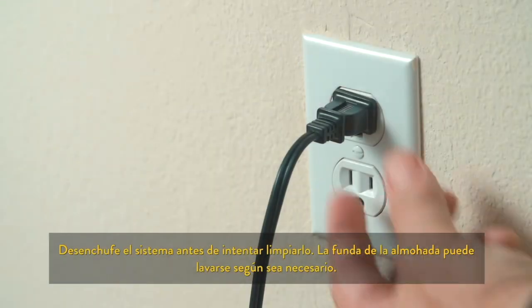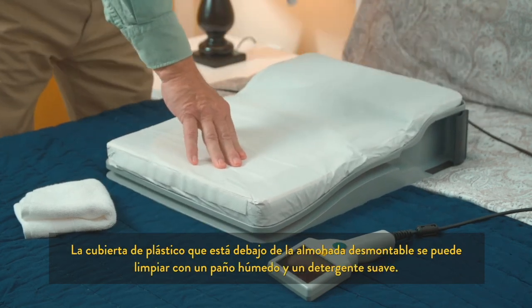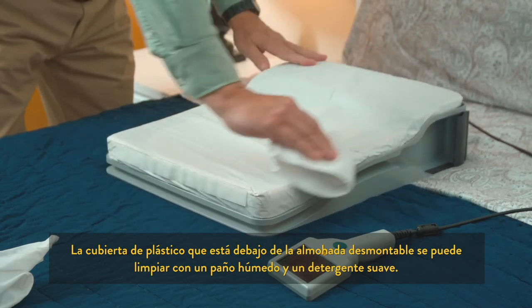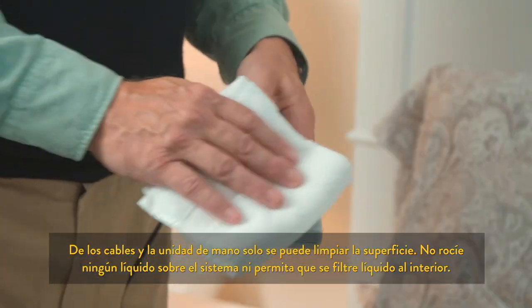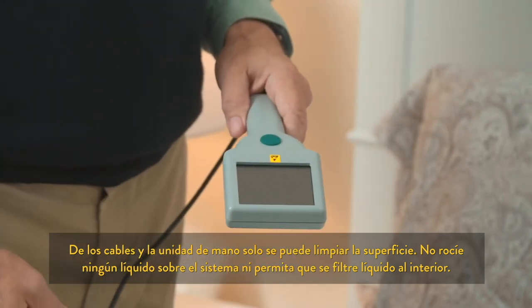Unplug your system before any cleaning is attempted. The pillow cover may be washed as needed. The plastic cover underneath the removable pillow cover may be wiped with a damp cloth using mild detergent. Cables and the handheld unit may be surface cleaned only. Do not spray any fluid onto the system or allow fluid to seep into it.